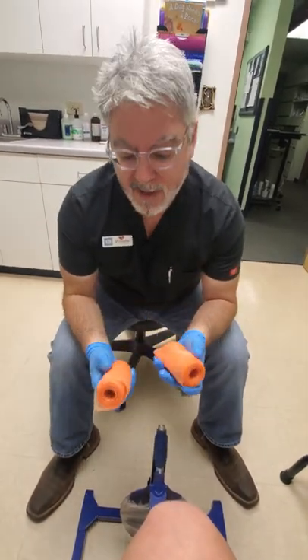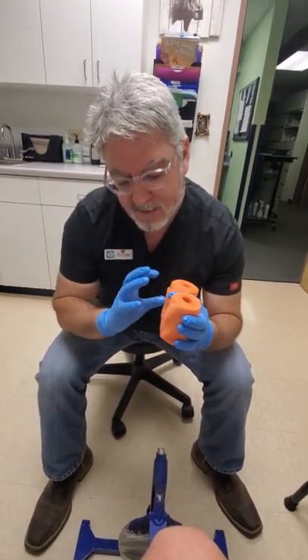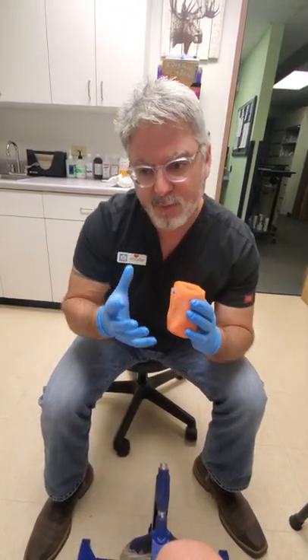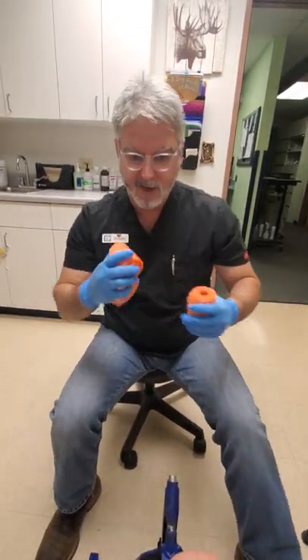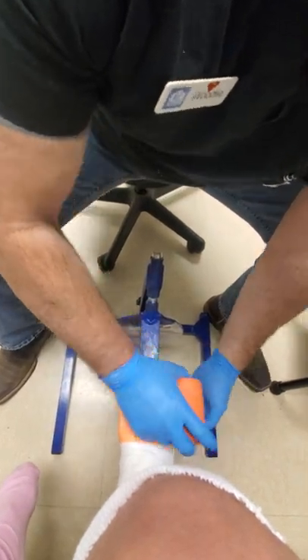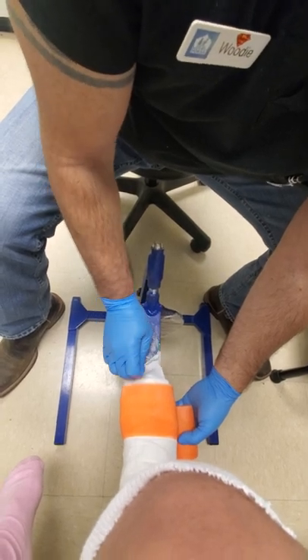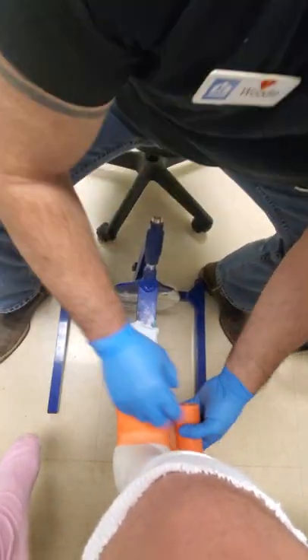This part is relatively important. I've gone ahead and wet the fiberglass already, and we're going to start rolling it. The most crucial part is that once you've gotten those first two layers of fiberglass on and it's starting to set up, we're going to transition from the first position of the cast stand to the second position — it has to be done relatively steady and promptly before the fiberglass gets hard. We'll try to do it all in one continuous flow. The patient's toes are right here — you can see the bump in the sock — and we'll bring this over and create a cuffed edge.